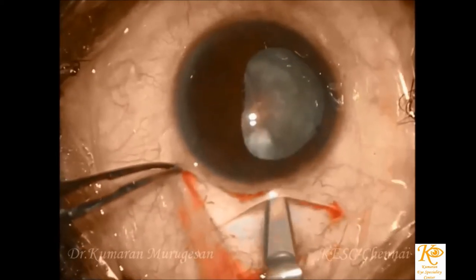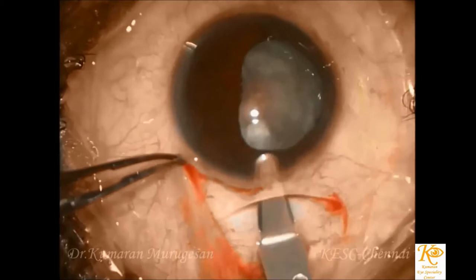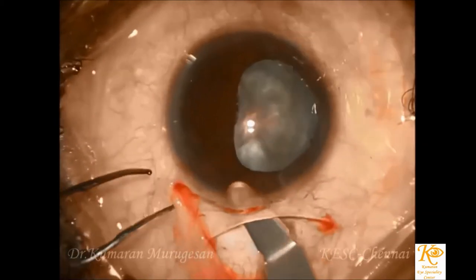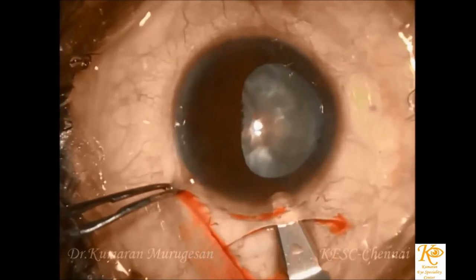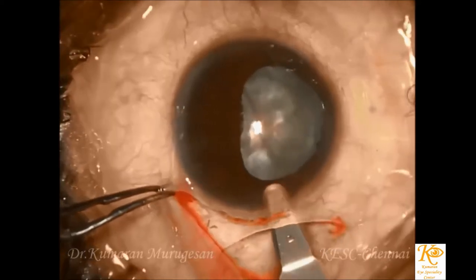After conjunctival peritomy and adequate cautery, a temporal curvilinear incision is made. The scleral incision is usually made opposite to the coloboma as it would be easy to perform the nucleus prolapse and other intraoperative maneuvers during the surgery.